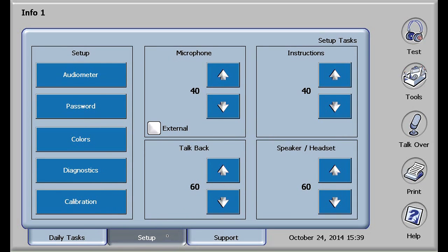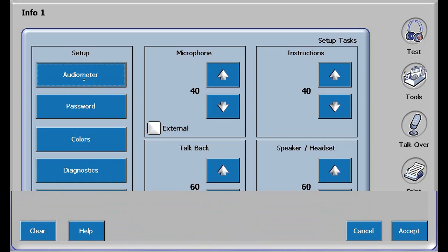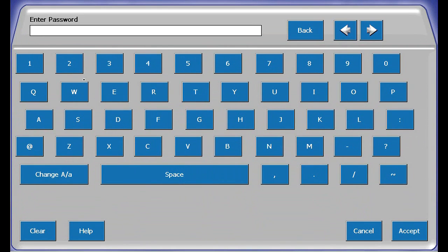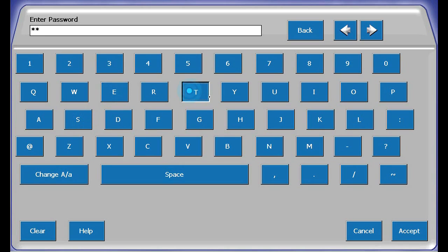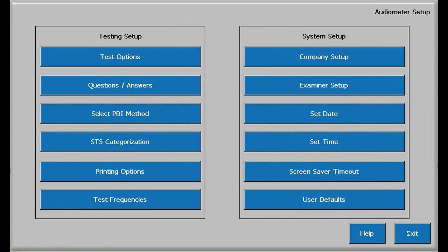The setup display allows configuration of all RA800 functions, but for now, let's concentrate on configuring the audiometer functions by touching the audiometer in the upper left corner. A supervisor password is required. The default is setup and that can be changed later, so let's touch S-E-T-U-P and accept in the lower right hand corner.